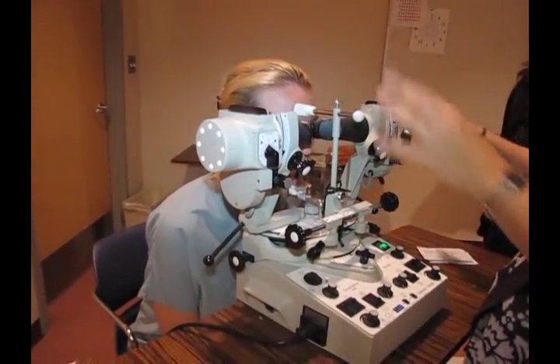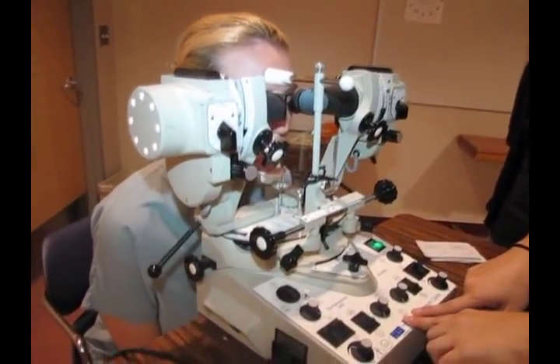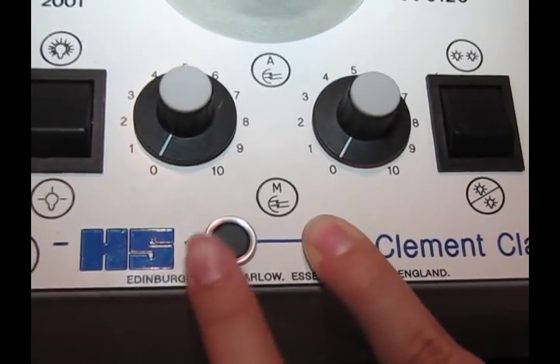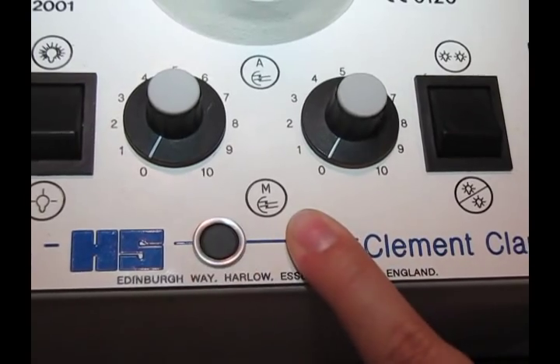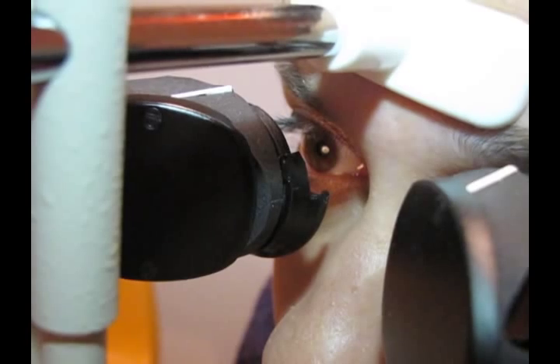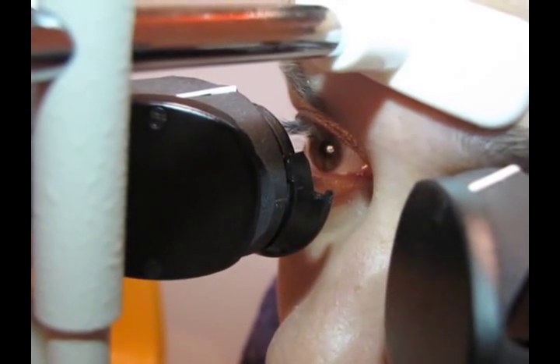So how come I saw a moderate amount? I'm just going to move one of them. And I'm going to repeat it. Ready, look. Ready, look. And now she's pretty neutral.